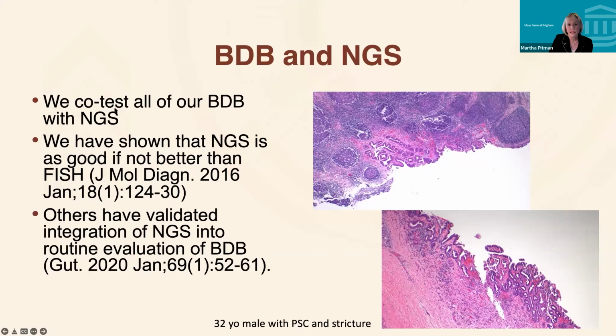So we definitely continue to co-test all of our bile duct brushings with next-gen sequencing, and we've shown in studies that it was as good, if not better, than FISH, and others have validated next-gen sequencing into their routine evaluation of bile duct brushings. At UPMC, they get a lot of specimens. They have a biliary panel that they do for their bile duct specimens.